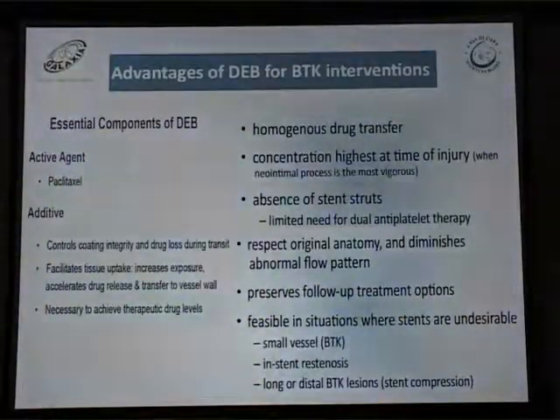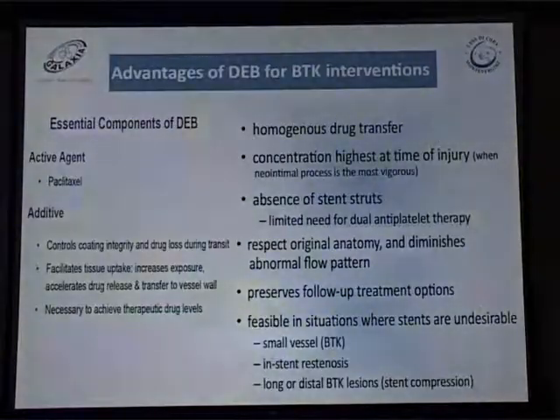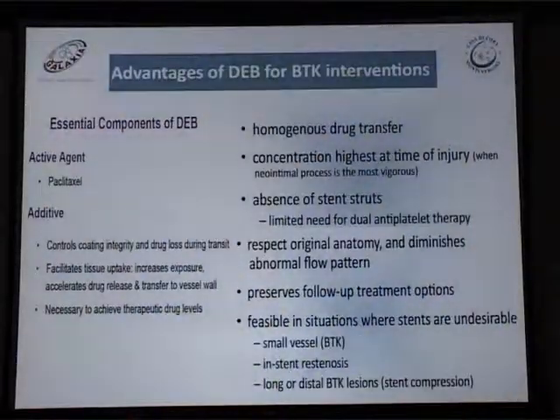Advantages of drug-eluting balloon for below-the-knee interventions are homogeneous drug transfer, concentrations highest at time of injury, absence of stent struts, limited need for dual antiplatelet therapy, respect of original anatomy and diminished abnormal flow pattern, preservation of follow-up treatment options, and feasibility in situations where stents are undesirable, for example, small vessels, in-stent restenosis, long or distal below the knee lesions.